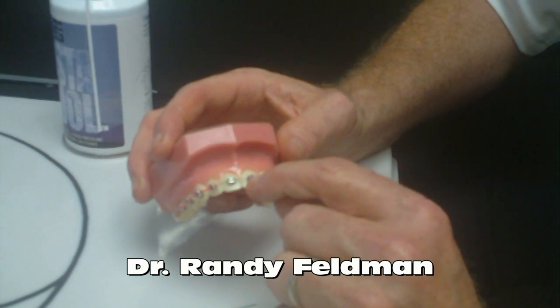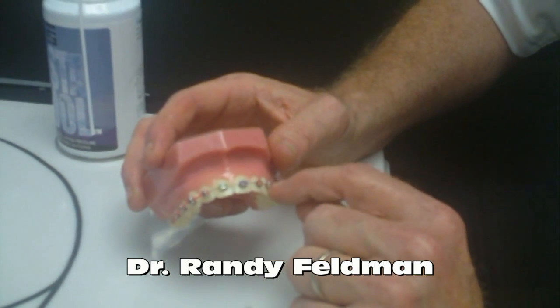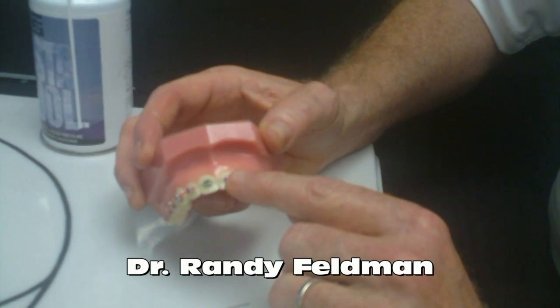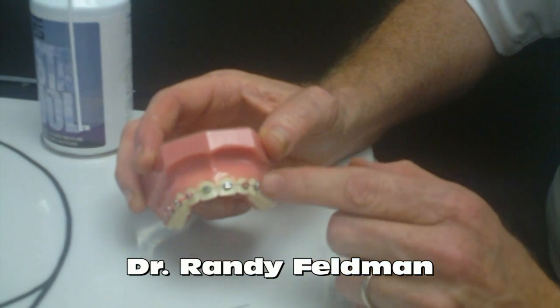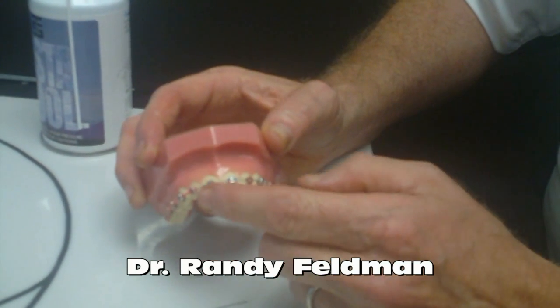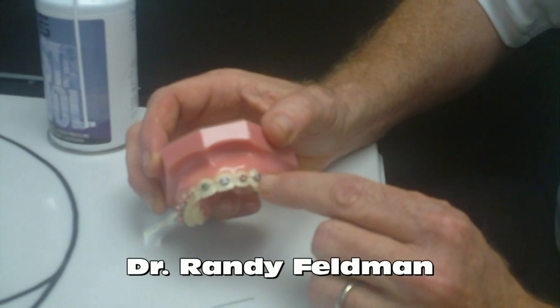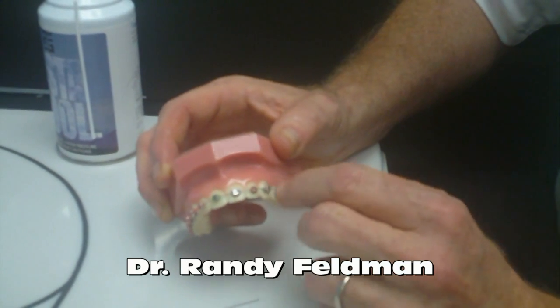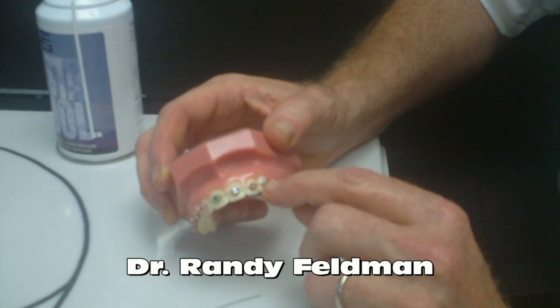Each bracket has a little slot in it. That slot has a very specific prescription, which gives us the torque and tip of every tooth. We tie the wire in or ligate it with either a colored elastic or with a steel tie. Both methods are fine, but the whole idea is to make sure the wire is fully engaged into the bracket slot.